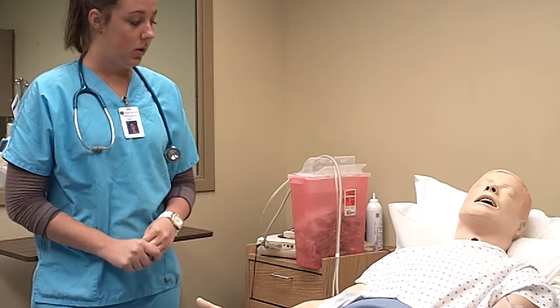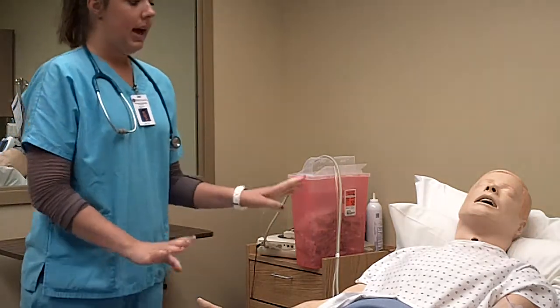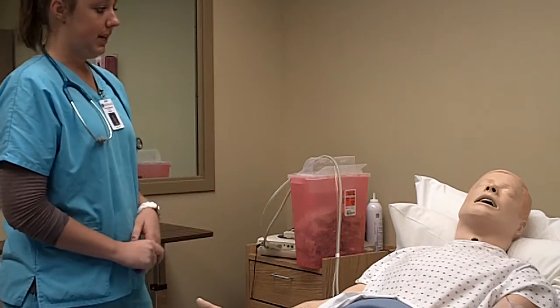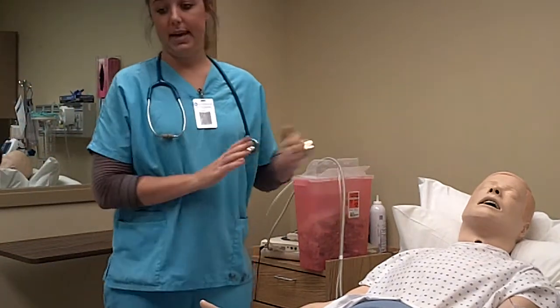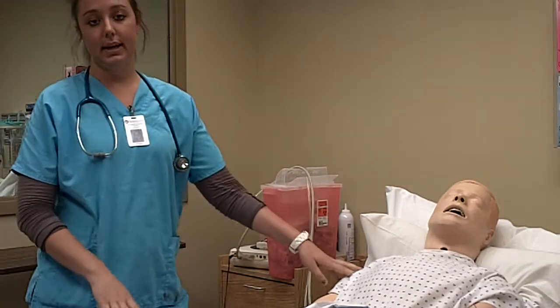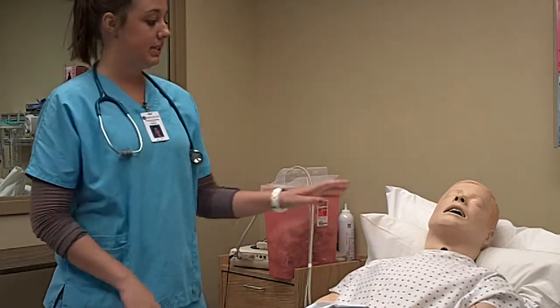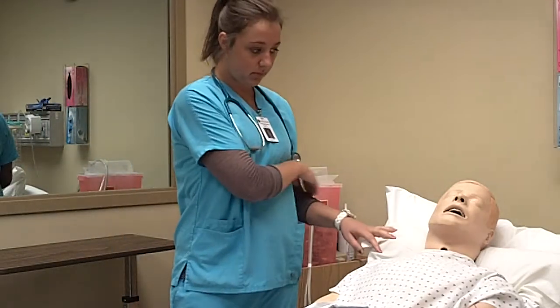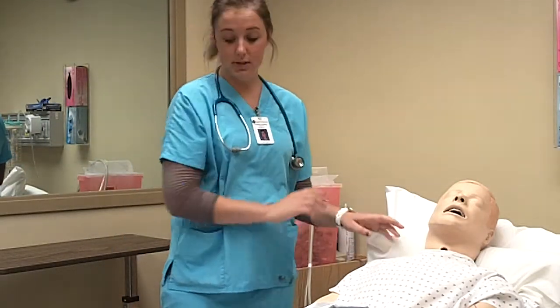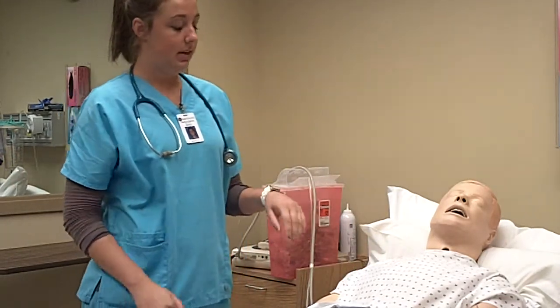And he is, so I'm just going to explain to him what I'm doing when I do it. I'm going to do my physical assessment on you today, and I'm going to work from the head down. Before I would enter the room though, we would take his height and weight, and I would take his temperature and his O2 sats on his finger, with the machines provided.